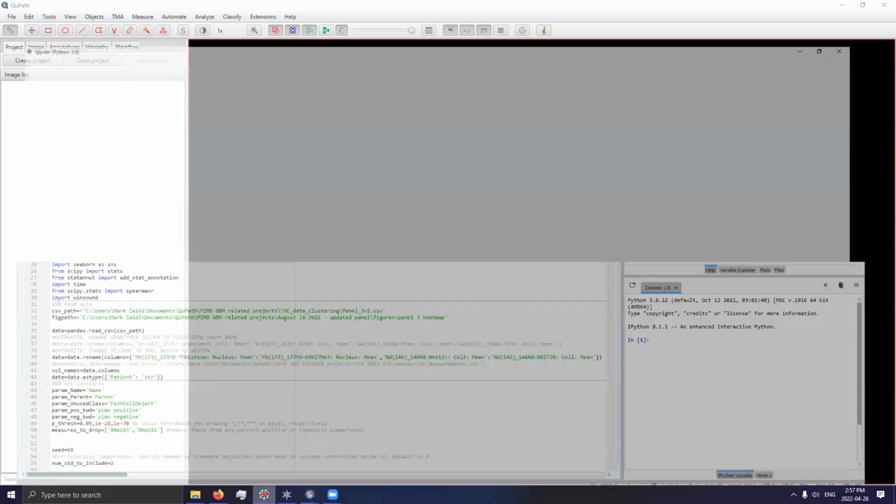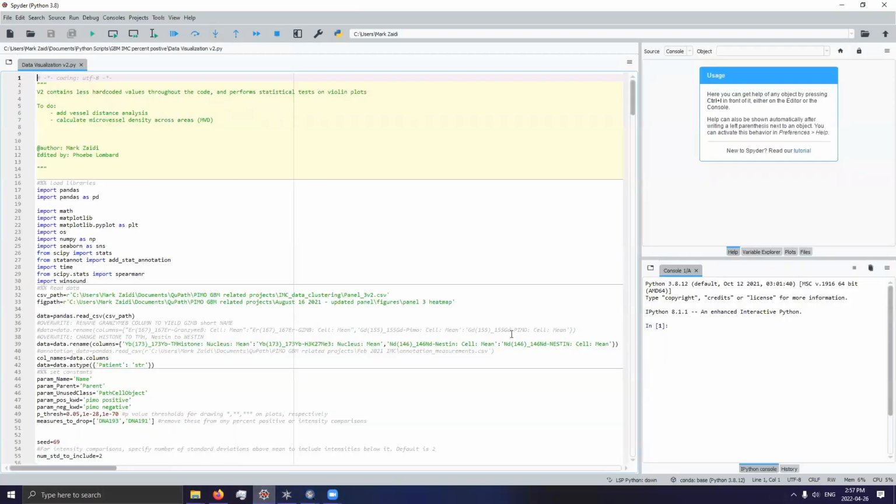And yeah, so then what you'll need next is Python, or if you're a Python programmer, maybe some kind of Python interactive development environment. My choice here is Spyder, but there are tons of Python environments out there for kind of user-friendly programming. So I'll be using Spyder later on for when you've actually exported the data out of QuPath, but you can use any kind of Python development environment, or even R.